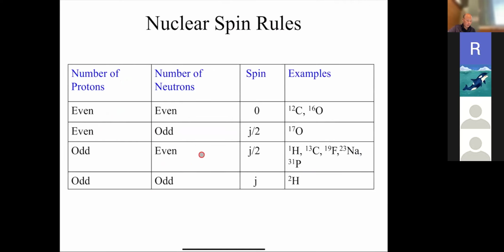So these are some nuclear spin rules, and for this course, we'll be focusing almost exclusively on the hydrogen proton. Although certainly for projects, if you want to delve into some of these other things that have MRI properties, you're welcome to do that. But most clinical imaging by far is based on proton imaging, okay? Because there's so much water in your body, there's just lots of signal, all right? And this has spin 1/2.